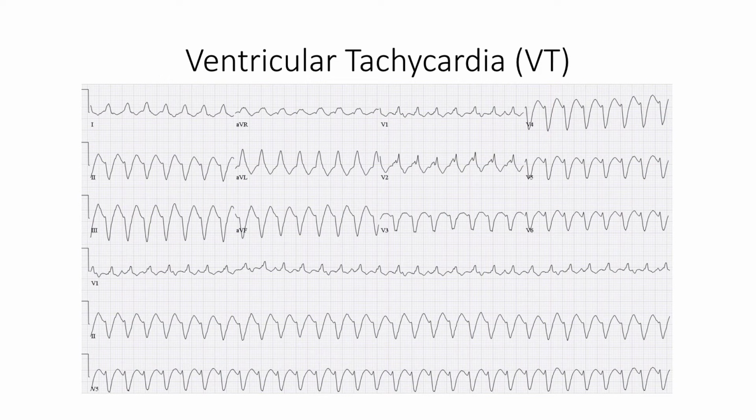Many times in post-MI patients, you have a repetitive run of VT that has the same shape QRS. This is from a phenomenon called reentry. The idea is that an electrical circuit can spin around and around a boundary like a scar, causing repetitive waveforms on the ECG like ventricular tachycardia.